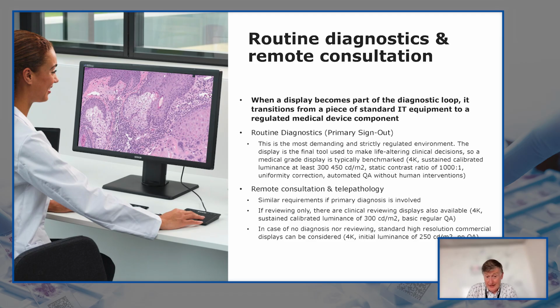So it basically means that people are asking for a typical benchmark: we need 4K, 8MP, we need sustained calibrated luminance, pretty high, 300, 400 candela per meter squared. You need a high contrast ratio with uniformity correction, 120 Hertz refresh rate, and you want automatic quality assurance because you don't want to run around doing checks with a manual colorimeter or a puck every 3 to 6 months.